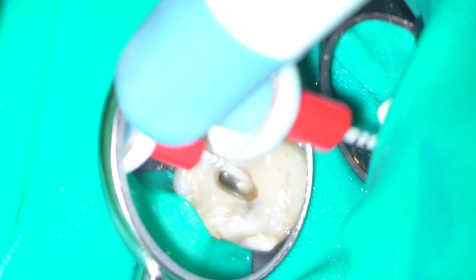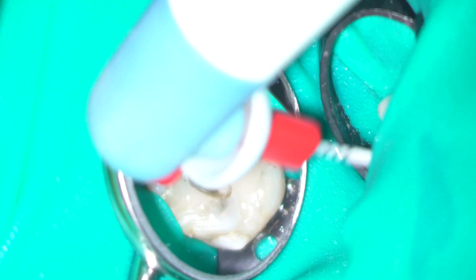I used an endoactivator to agitate the irrigant during the irrigation phase.